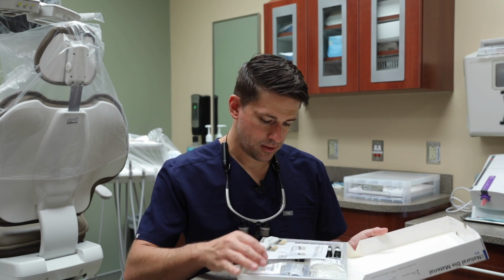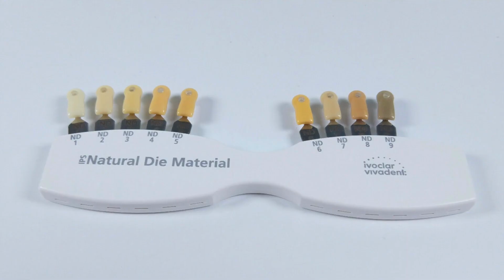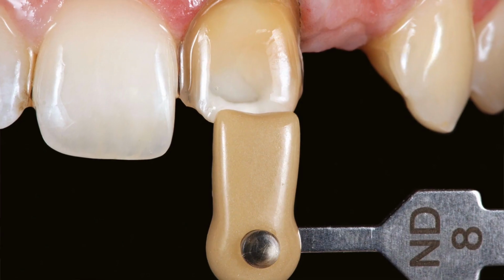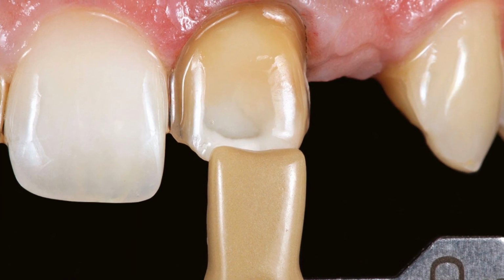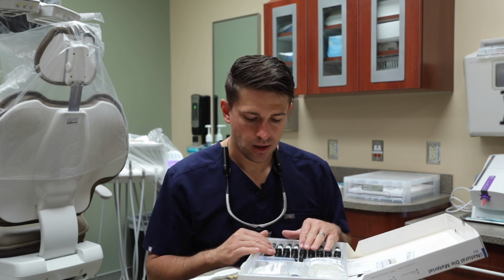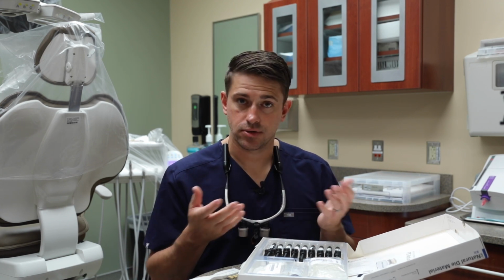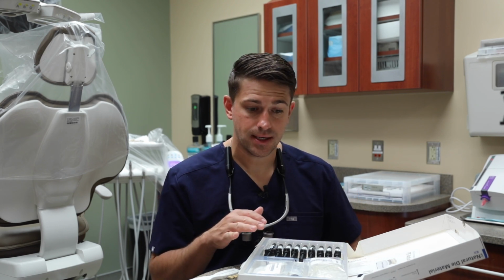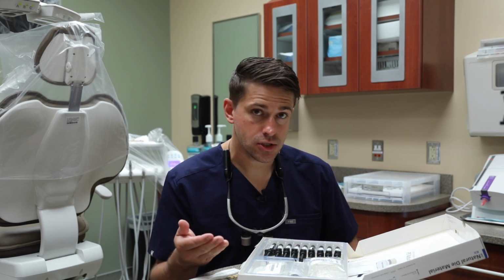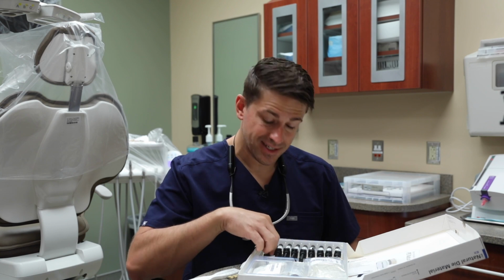I mentioned earlier that you can use a prep shade guide, which is this right here, the Natural Die Material prep shade guide. And you're going to pick which one of these is closest to the actual prep of the tooth. So you can use this to help you get a better understanding of what your crown is going to look like on the natural tooth while you're still working on it and characterizing it and glazing it. For the custom shade guide, this is going to represent the die that all these different crowns are going to sit on. Now, if I was you, I would start by making the most popular shades that you use on the regular. For me, that's like A shades, maybe some B shades. And so I'll make all these different crowns in different shades. And then there are 9 different die shades in here.